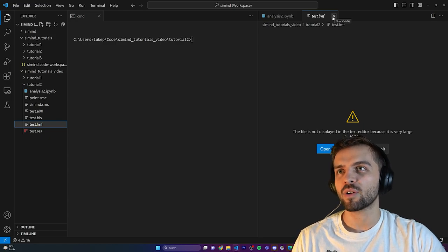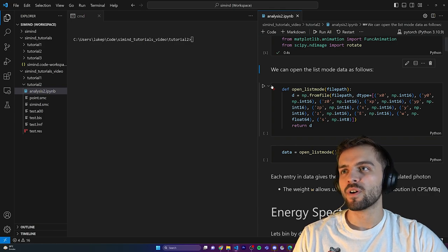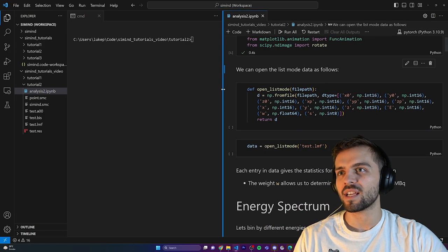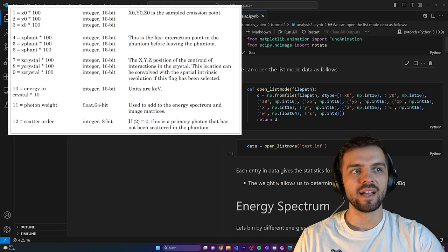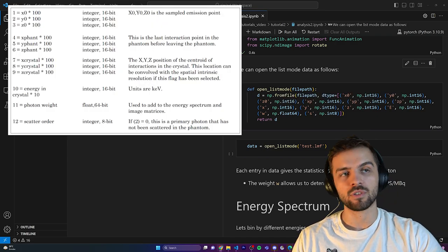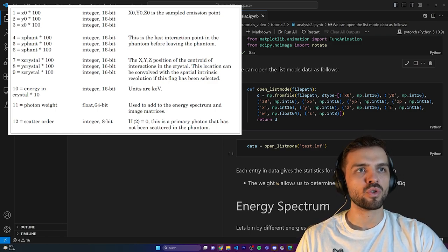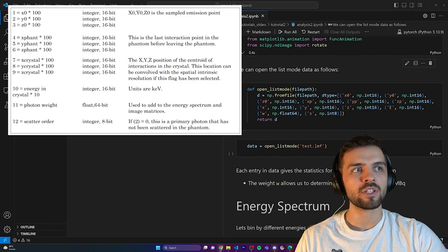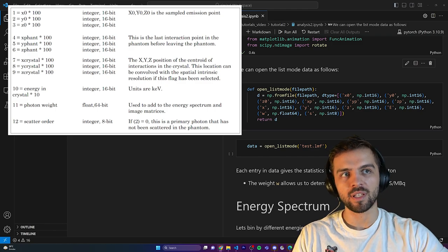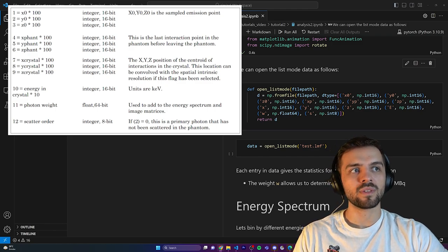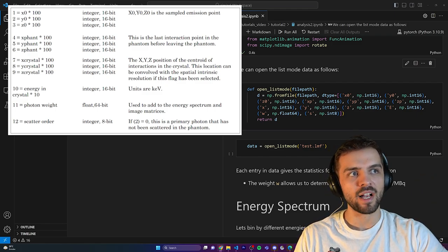The question is how do you open this file to get access to its data? I've written a function that does that. The list mode data is stored in a particular format covered by the user manual. As shown on screen, list mode stores the sampled emission points — for all 5 million photons it stores the location where the photon was simulated, plus the last location of the photon before it exited the phantom.